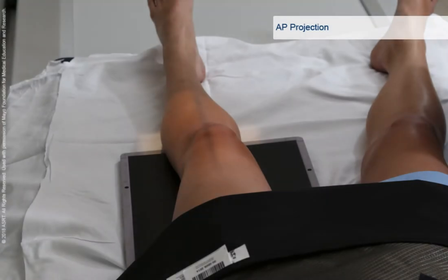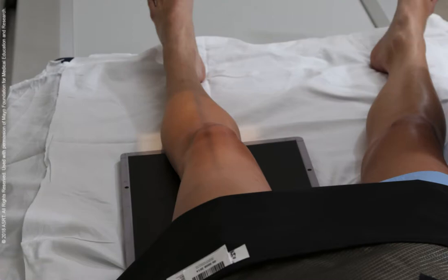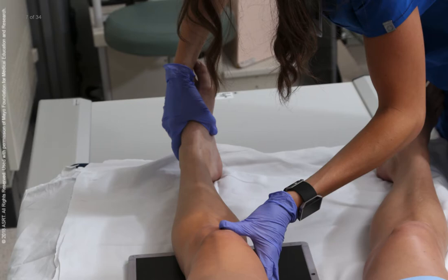Positioning for an AP projection of the knee begins with the patient supine and the affected leg extended. A curved image receptor is used if the patient is unable to fully extend the leg. Make sure the patient's pelvis is not rotated. The image receptor is centered to the affected knee joint, located approximately half inch or 1.3 cm below the apex of the patella. To place the knee in a true AP position, adjust the rotation of the patient's leg until the femoral condyles are parallel with the plane of the image receptor. In this position, the patella usually lies slightly toward the medial side.